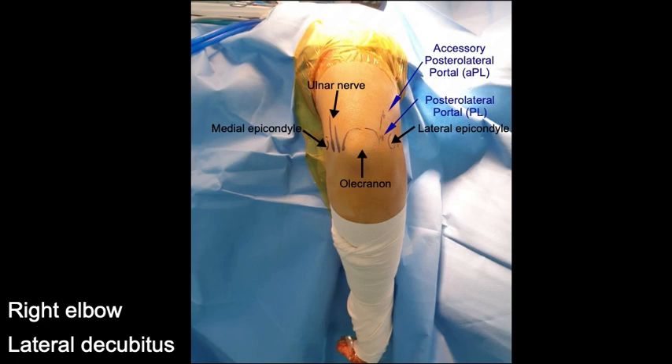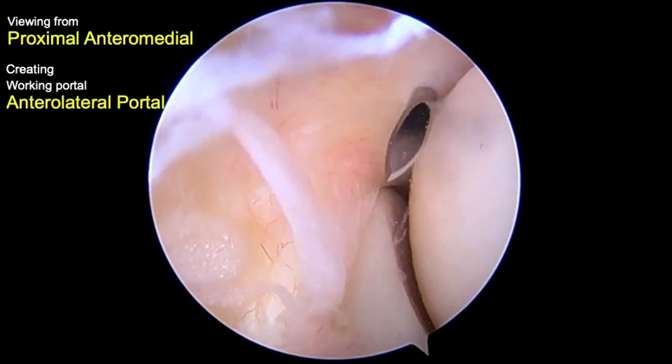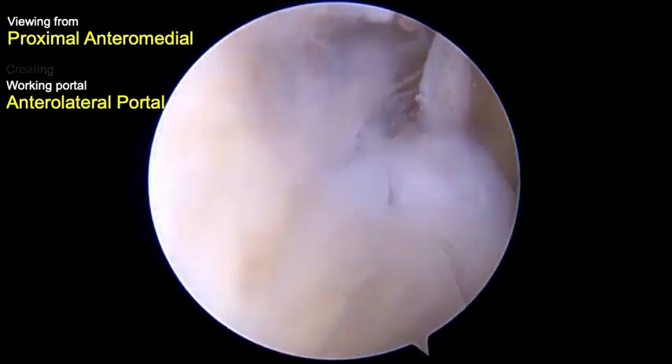In lateral decubitus, the right elbow was put on an arm support, starting at the anterior compartment. A proximal anteromedial portal was initially made as the viewing portal, then an anterolateral portal was created as the working portal.